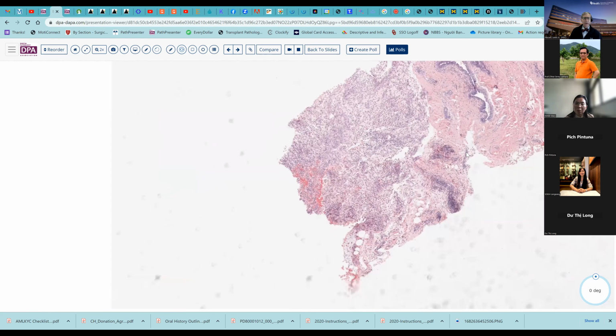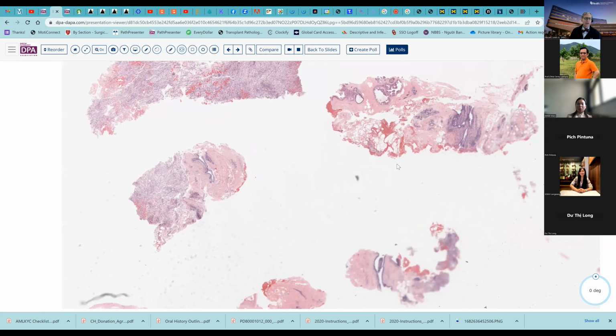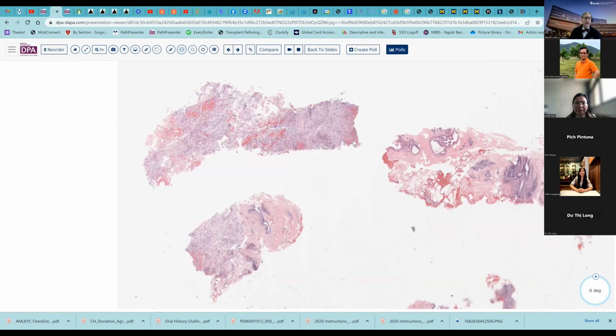So why is this not just an abscess or a reparative wall of a granuloma or something like that? Well, that's where the USP6 rearrangement comes into play and helps you to define that. Now, unfortunately, there's not an easy immunohistochemical stain, and so you may have to go on other features, lack of other features, and so forth to make your diagnosis.